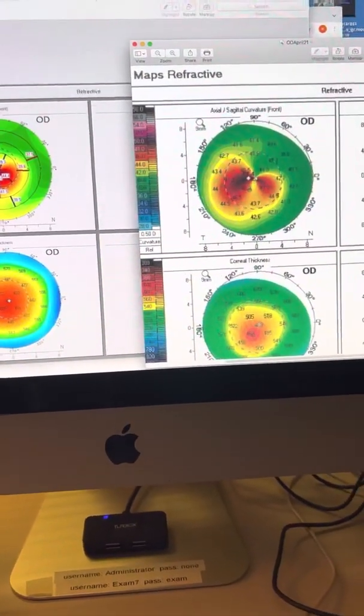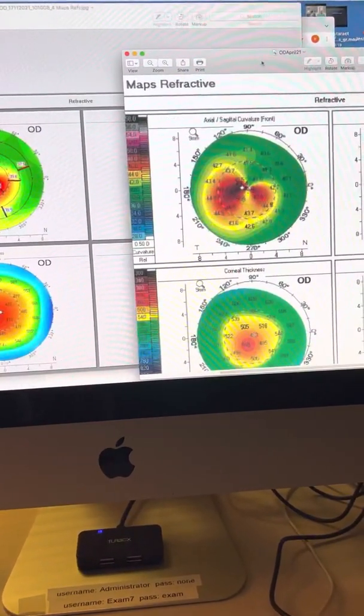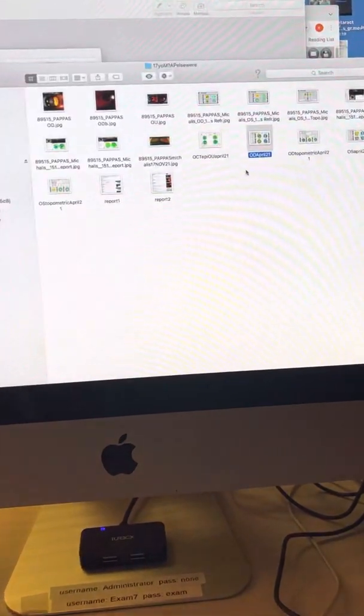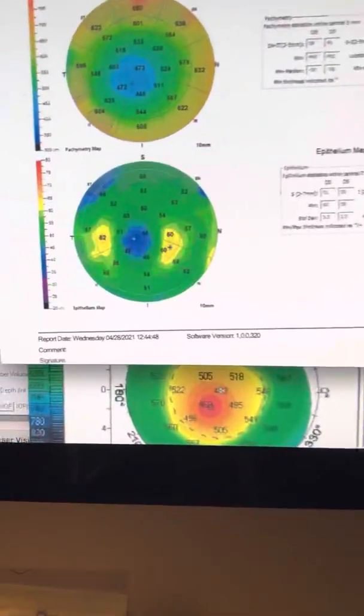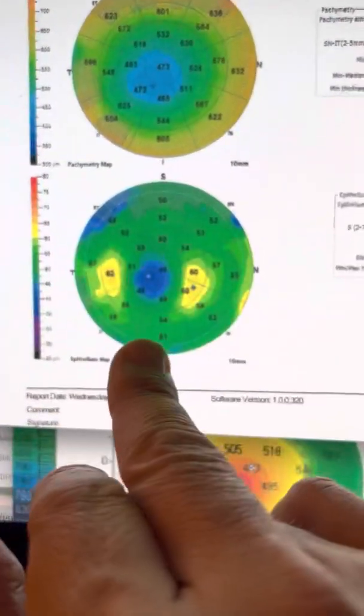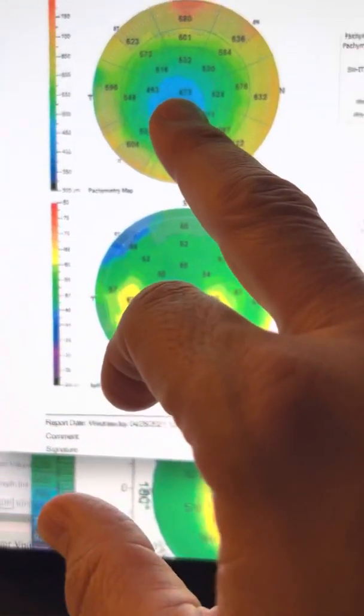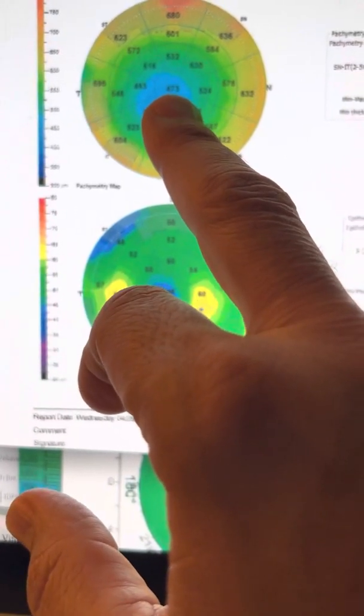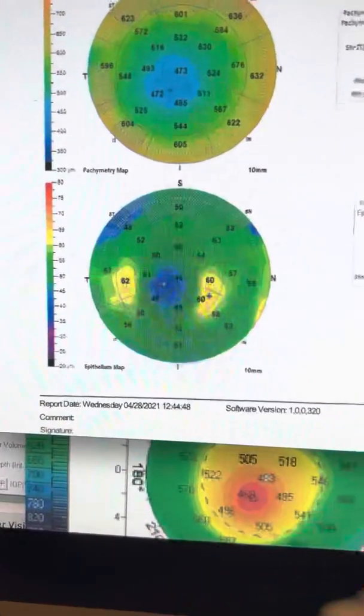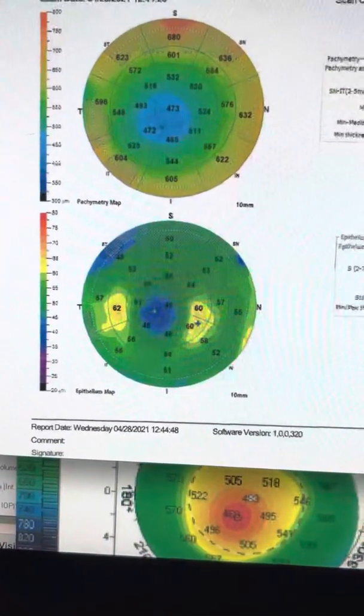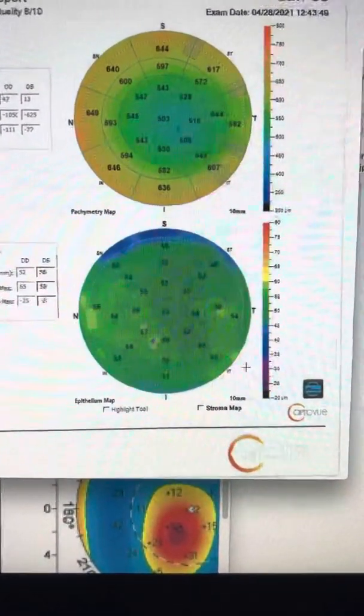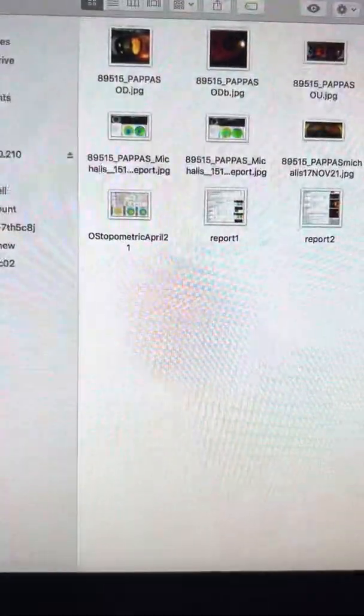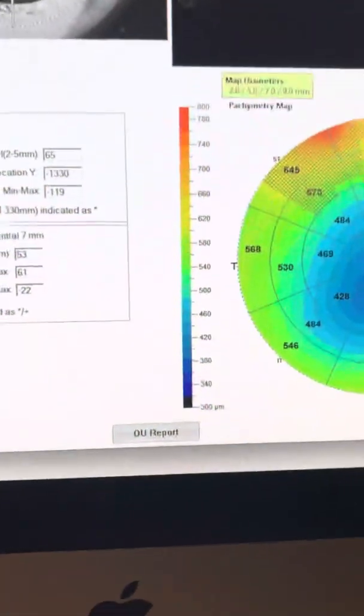We would have in question whether this was a laser and not CXL alone. It is answered by the fact that the minimal thickness centrally prior to the procedure was 473, and we can see also the epithelial distribution on the right eye that was treated. Left eye, by the way, was naive at the time, and these images continue to be similar today.